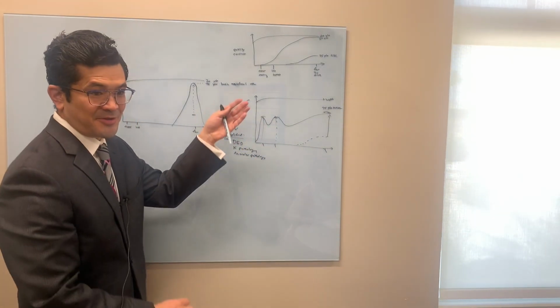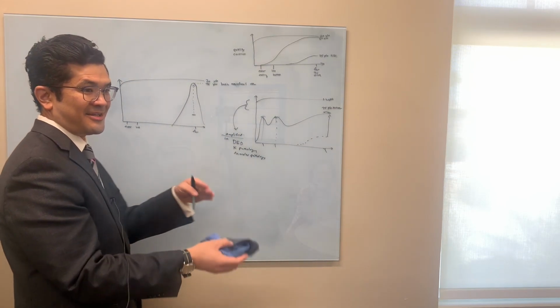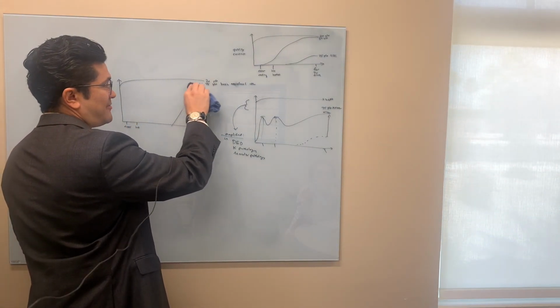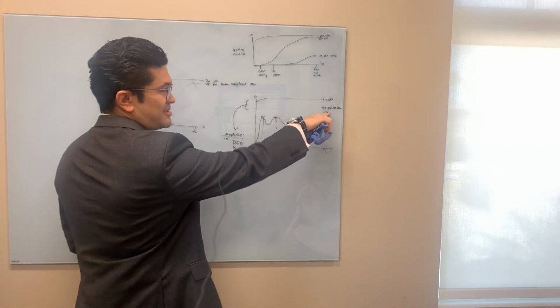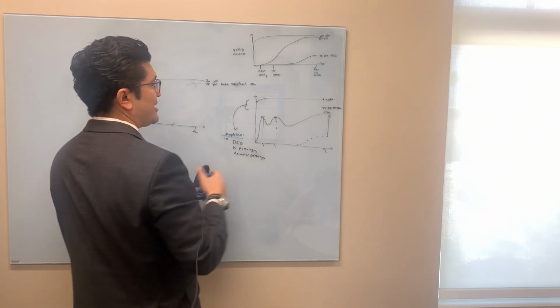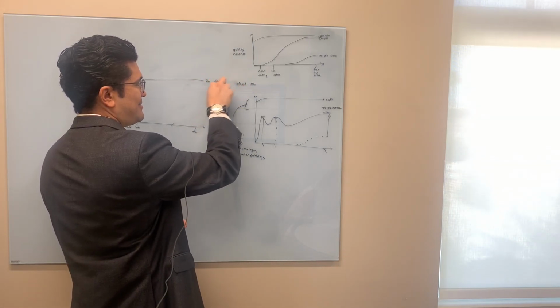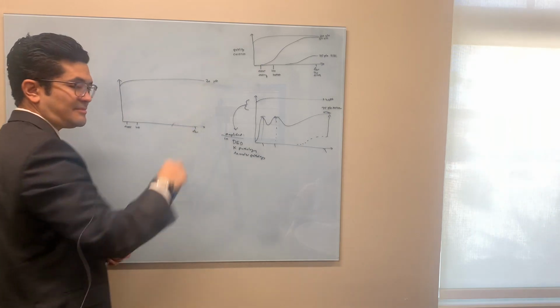That concept of defocus curves, I think, is helpful, right? Now you can understand why we kind of gear some patients one way or another. For instance, you have your patient who's a pilot or a truck driver. We don't even want to do this to them because their contrast is going to be reduced. They might get 20/20, but they might have a reduced quality. And for someone who's driving at night or flying a plane, maybe not a good person to put a multifocal in.